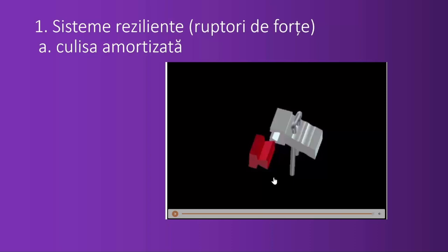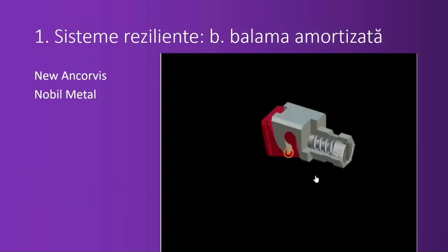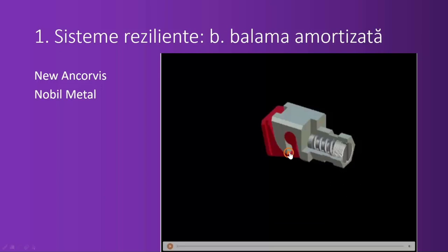Those systems, those attachments, nevertheless had too much mobility and created problems. Too much mobility is not good. Okay, now the second type, the hinge. Well, this is way more evolved.